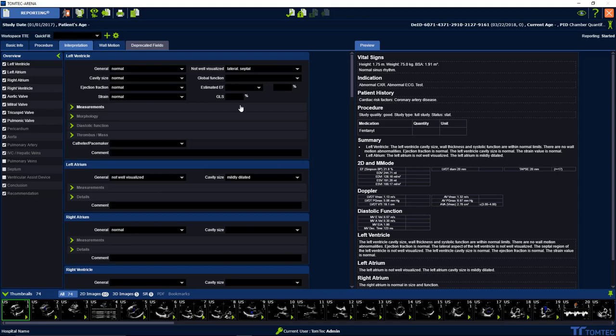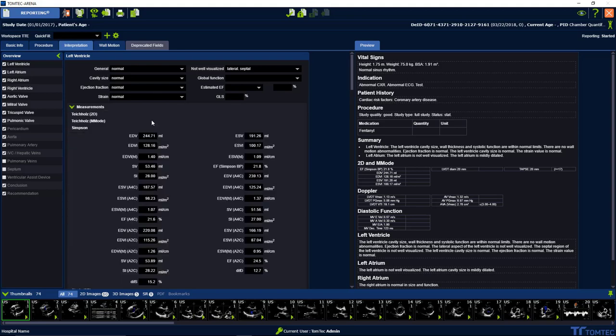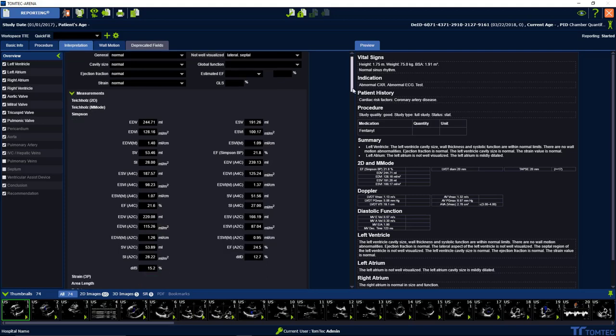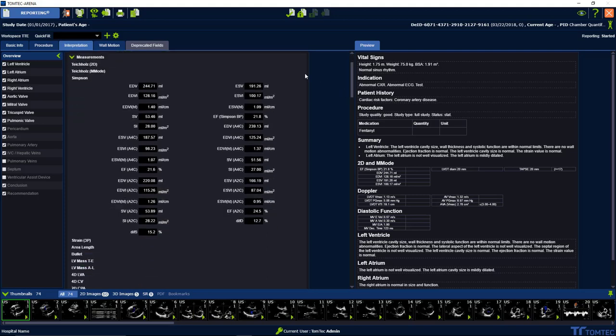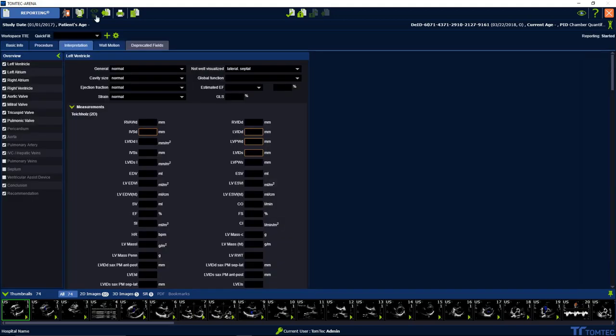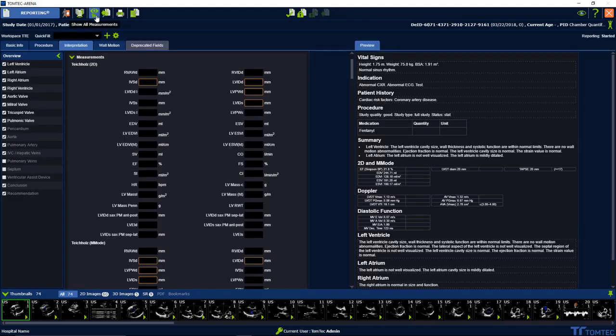Show all measurements means if you go down for a drop down here in the left ventricle measurements, that means show all the measurements or hide all the measurements.